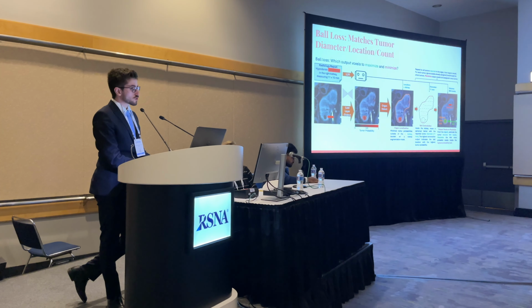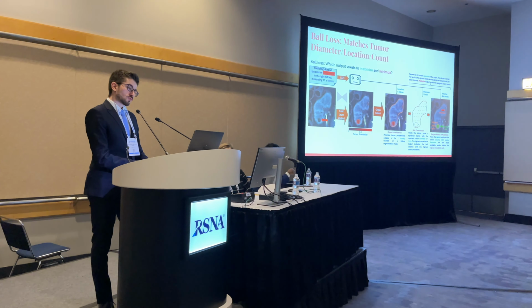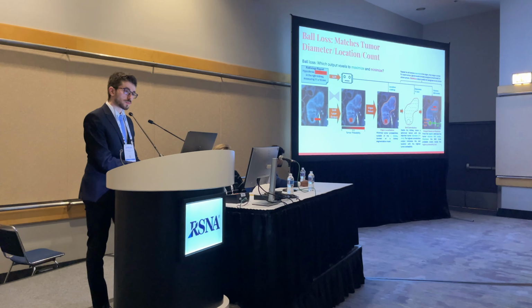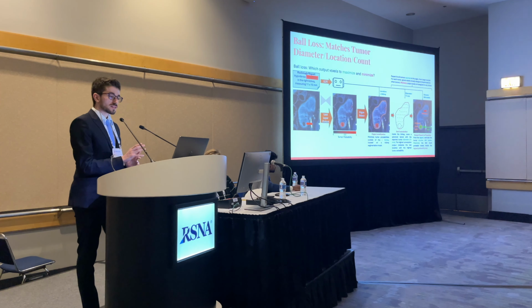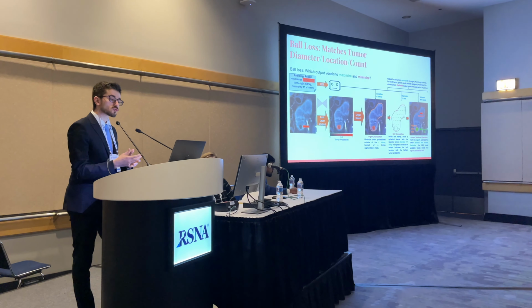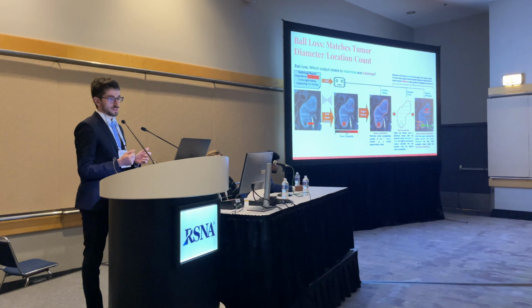The second loss function is a little bit more complex, but it makes the model segment tumors that match the diameters, locations, and the number of tumors in the reports. For that, we use a special convolution that we named ball convolution to locate inside the segmentation the most likely location for each tumor mentioned in the reports, according to their diameters and the organ where they are.